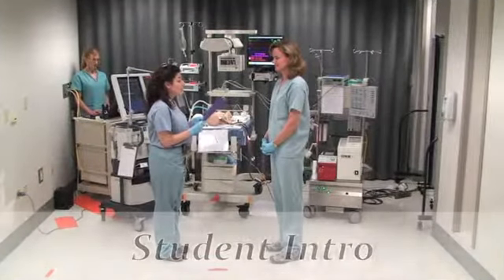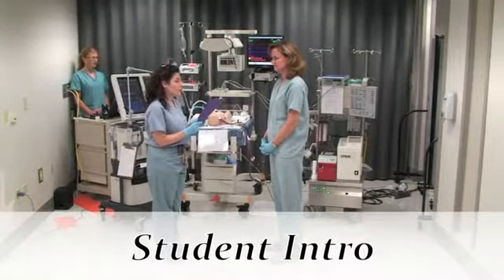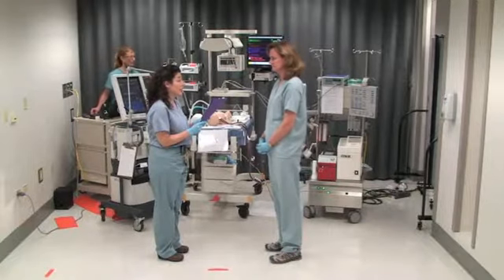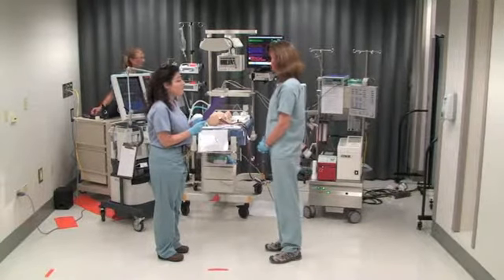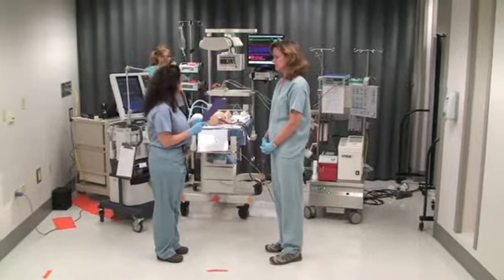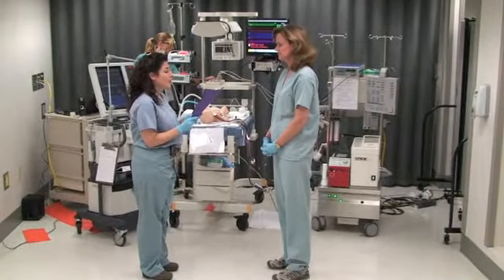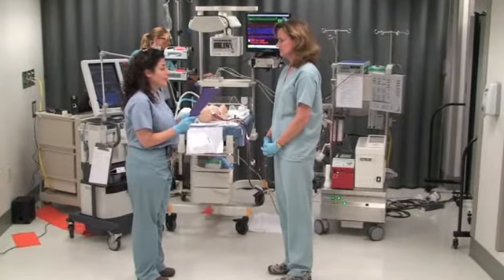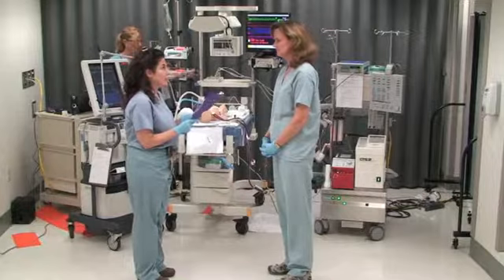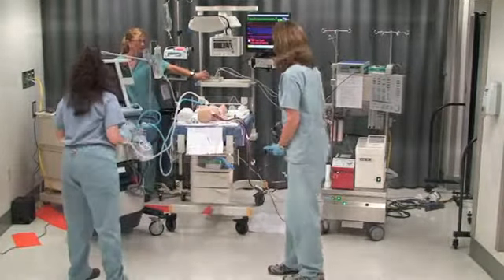This is day three for a two-month-old who presented with VTAC unresponsive to medical intervention. He was found to have anomalous pulmonary venous return. He's awake and sedated, calm and quiet. The nurse has just completed his assessment with a diaper change and I'll be your nurse for this scenario to be available.